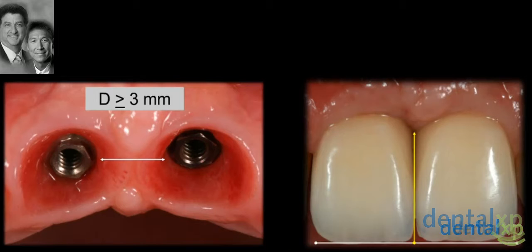So we kept it 3 millimeters apart, like you see in this clinical case. And Steve, what did you see? Still have a short papilla. Absolutely. We have a little scallop, so we got away with it, didn't we?